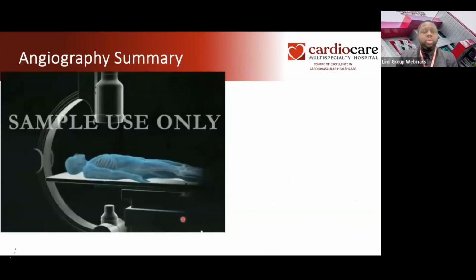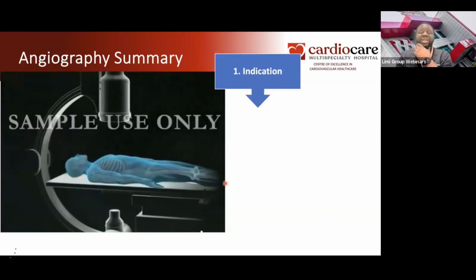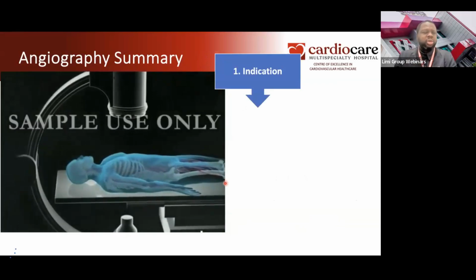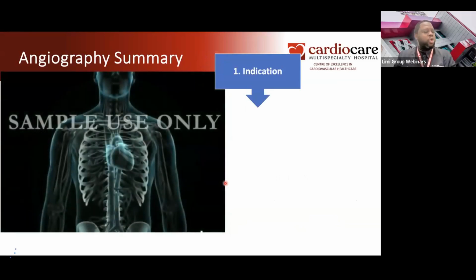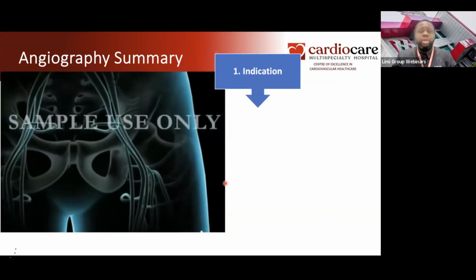All right, so we're showing the procedure of coronary angio, and we said first is make sure of the indication. I'm just giving a summary as we go on. We've gone through the indications: acute coronary syndrome, determined chest pain, MIs, heart failure assessment, patient having ongoing chest pain with high-risk features, and different other reasons we have shown.